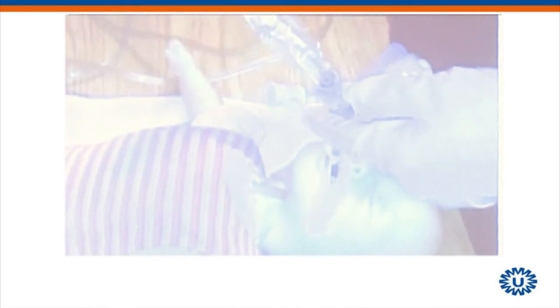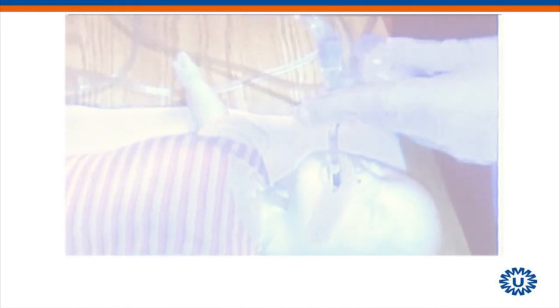This is the open suction method. What do you think of it? Is it more or less comfortable for your patient? Yes. This is the one you already know. This is the closed suctioning method. Are you all using this system?